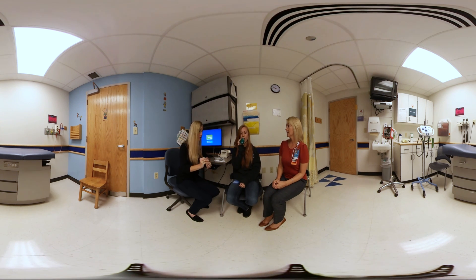You want them to exhale out forcefully enough that you can feel good vibrations throughout their lungs. If you do not feel that, have them blow a little harder.